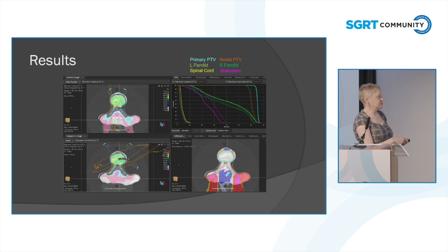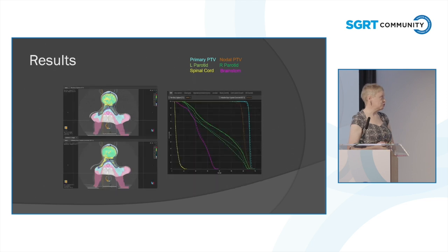And when you look at the PTV coverage, both for the primary in the blue and the nodes in the brown, the plans are comparable, so we were happy to proceed to treatment on this. And I'll come back to a bit more of that in the results. Oh, no, there they are, in the results later.